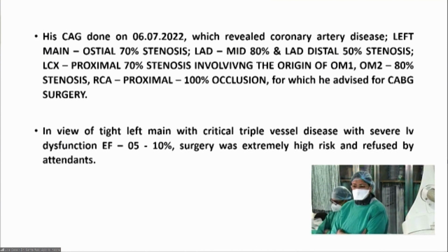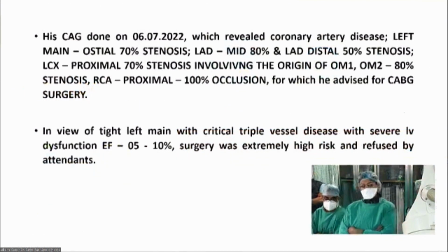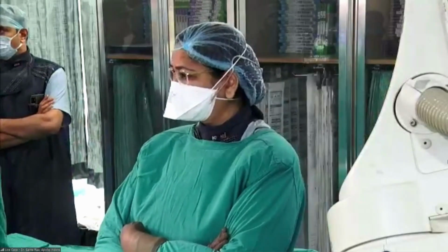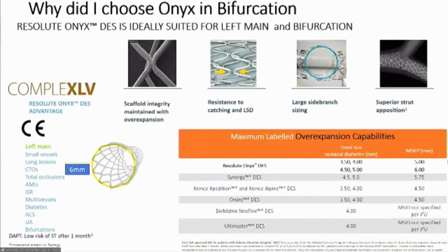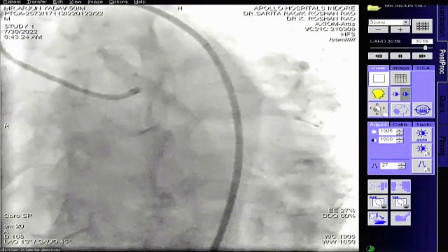Next, please. So let me show you the angiogram now. Can you play the angiogram? Hemant, can you see the angiogram now? Not yet, Dr. Sarita Rao. Can somebody play the screen now? Can somebody play the angiogram screen? Yeah, we can see the angio.